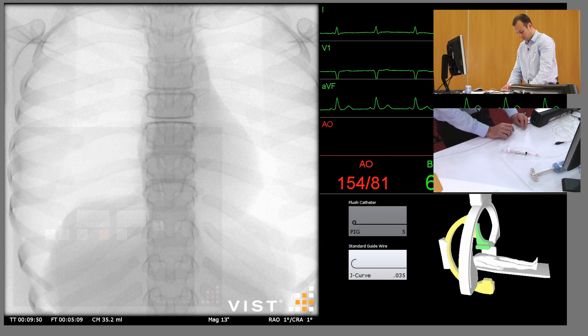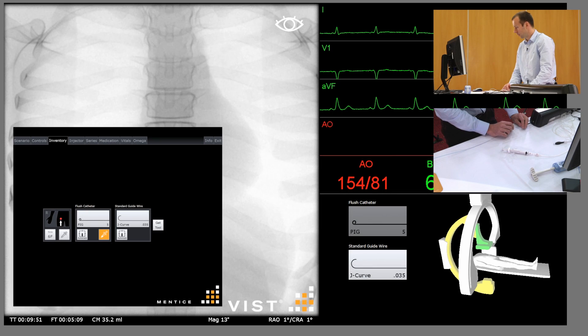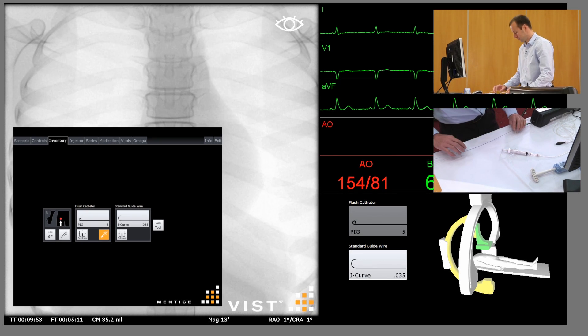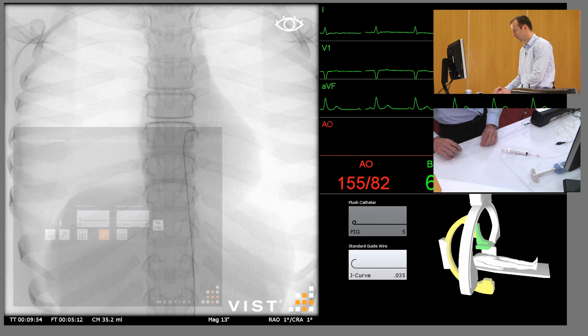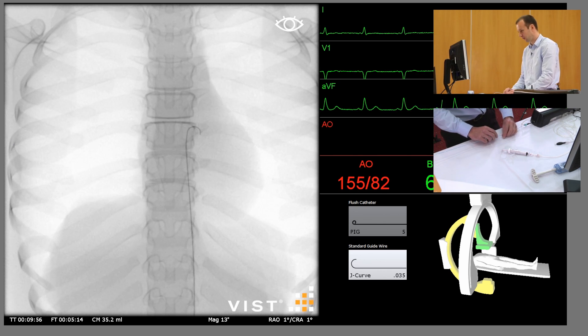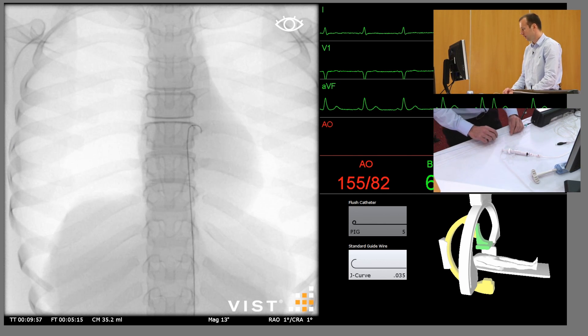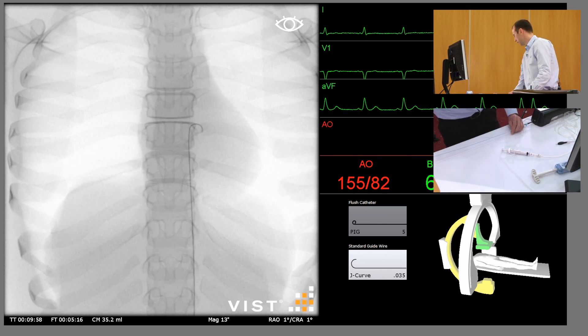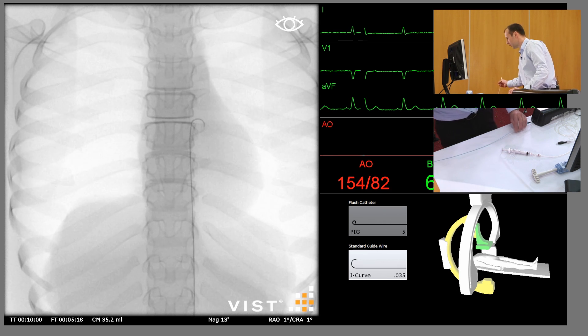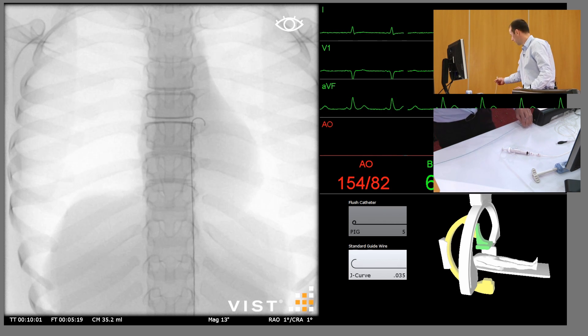We'll start as always with a standard J-tipped guide wire, which we advance into the descending thoracic aorta, and over that we're going to introduce a pigtail catheter.